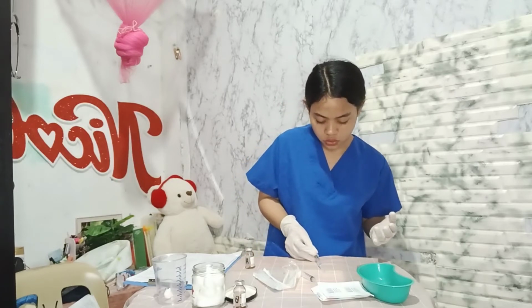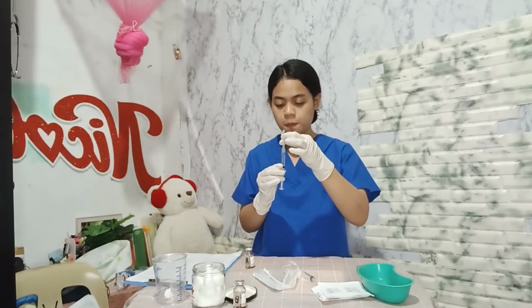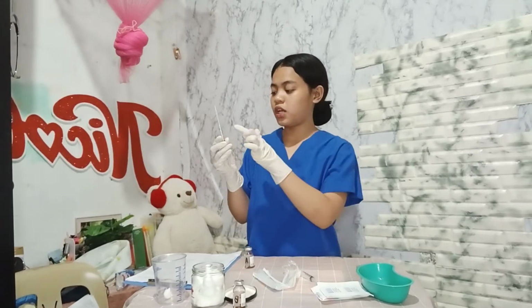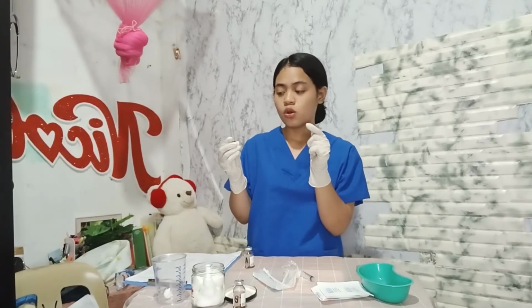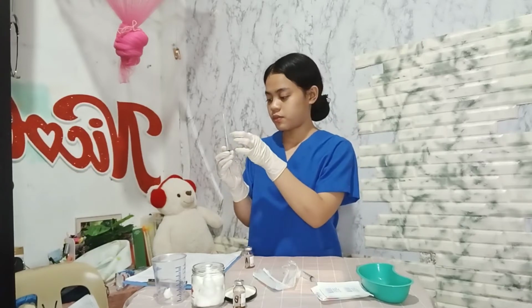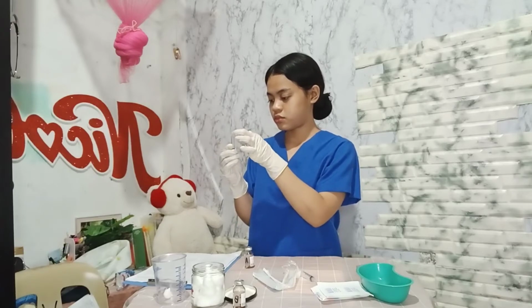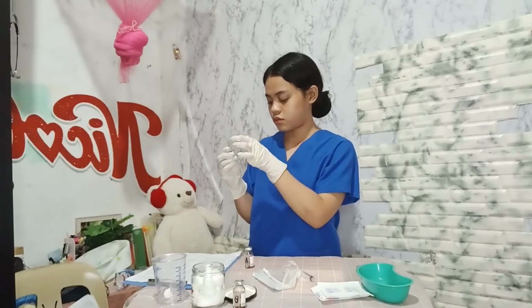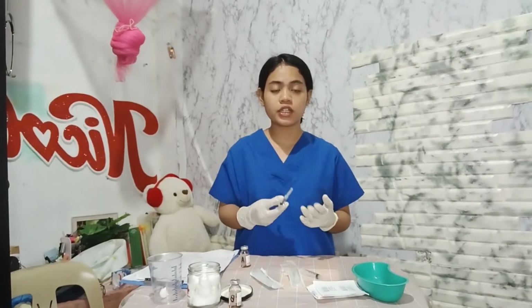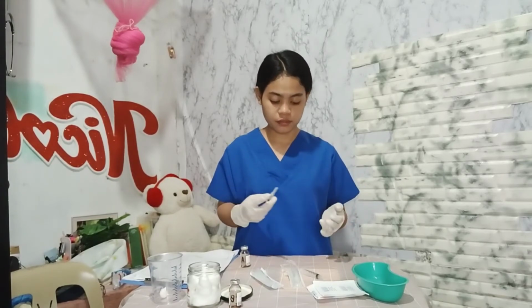Do not touch or hold the needle to maintain its sterility. Then, if necessary, tap the syringe barrel to dislodge any air bubbles present in the syringe. Then next, if giving an injection, replace the filter needle, if used, with a regular or safety needle with the correct gauge and length.